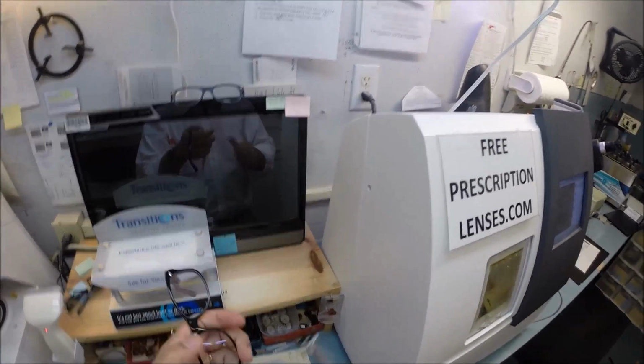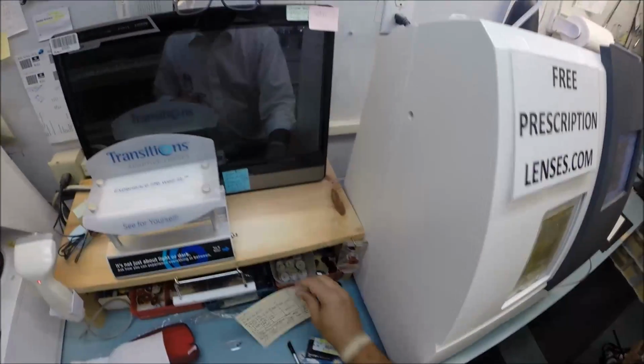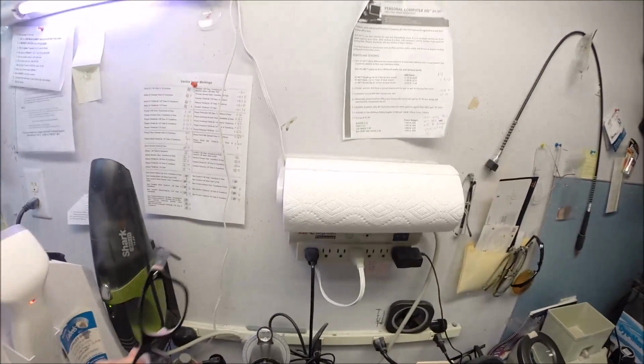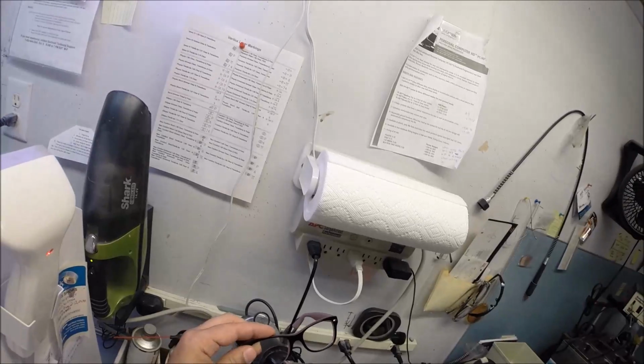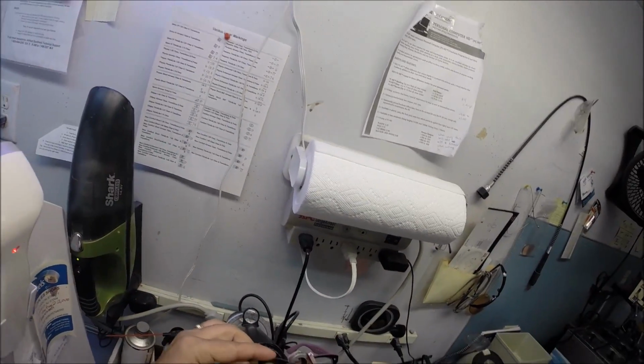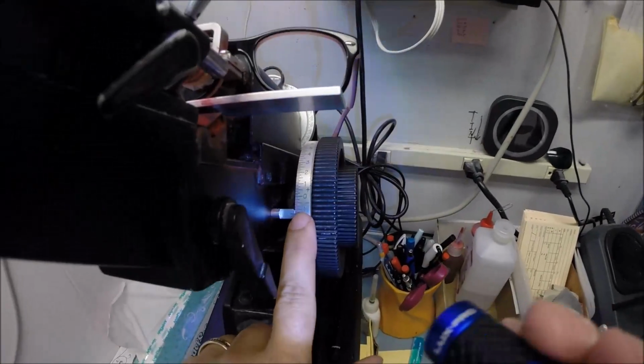So let's go ahead and take this block off. We're going to come back down here to, what kind of lensometer is it? Marco Polo. Marco Polo. Put it in over that dot. You see that dot right there? Put it in over that dot and check the power, and we're getting -1 1/4.